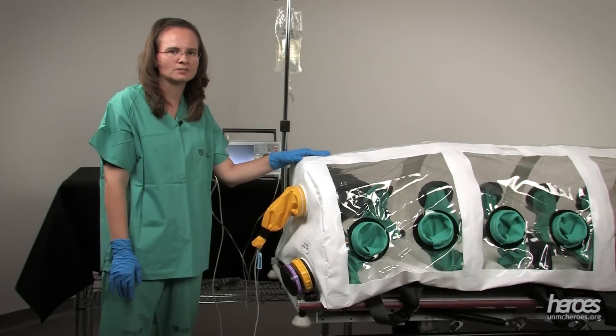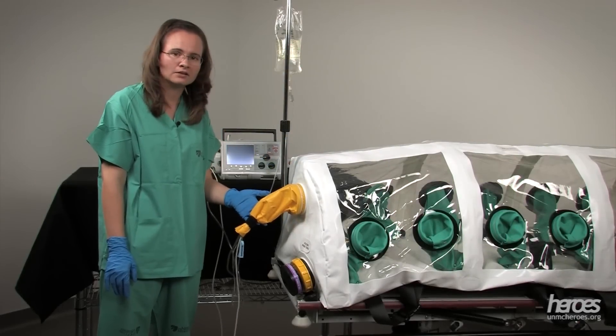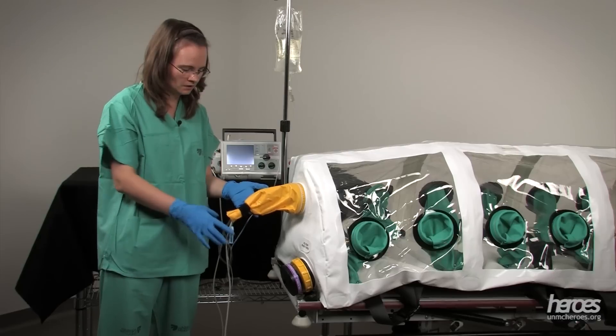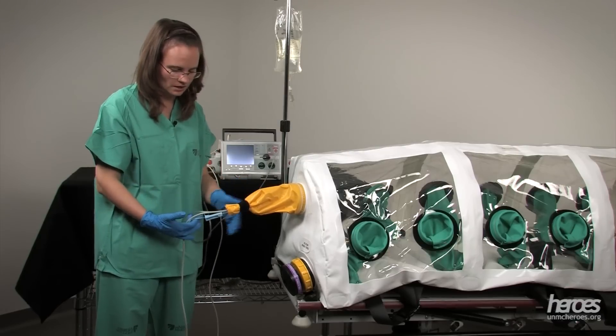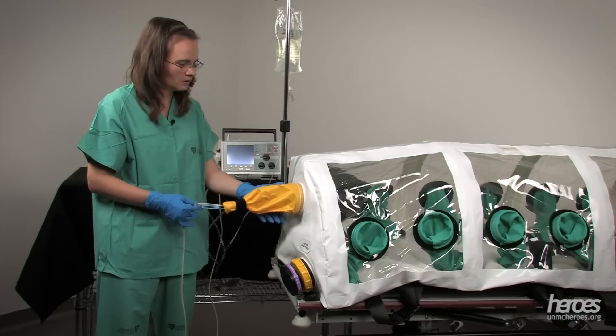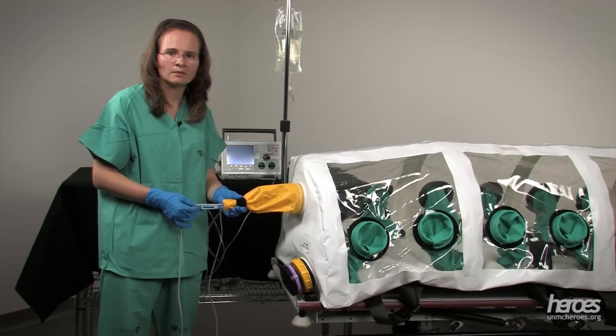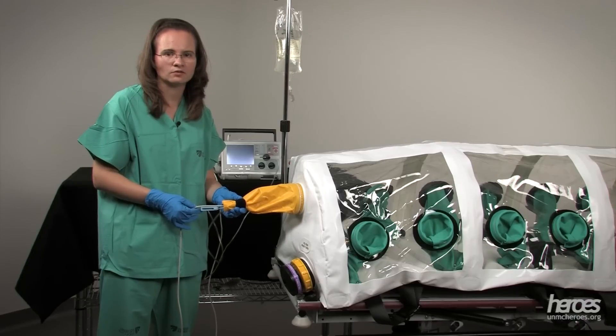The isopod has multiple access points. You will find a snorkel port on either end of the isopod. The snorkel port is a way to fish in lines for oxygen, monitoring, or intravenous lines. The port is an opening into the isopod, so we need to keep the Velcro strap nice and tight to maintain the negative pressure.